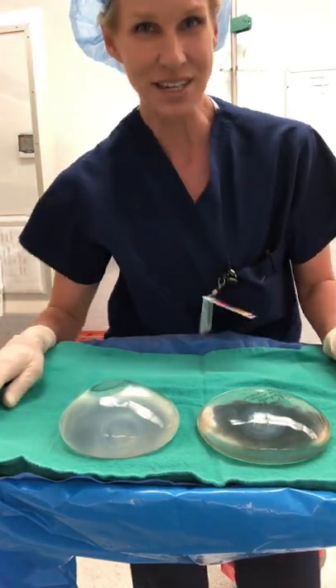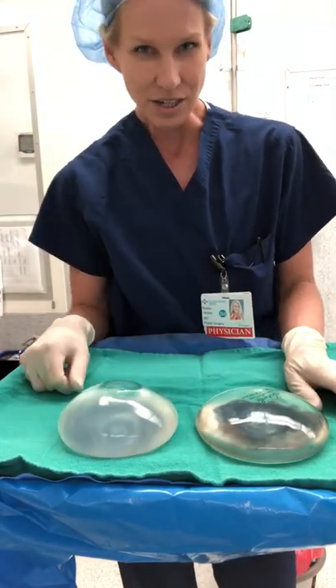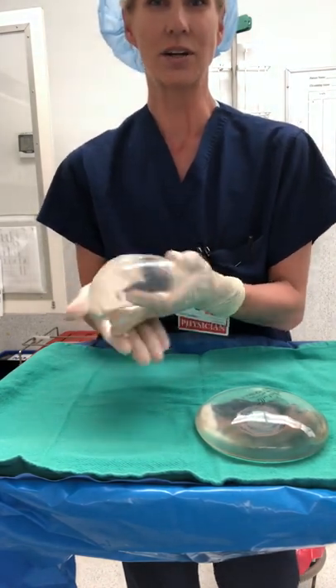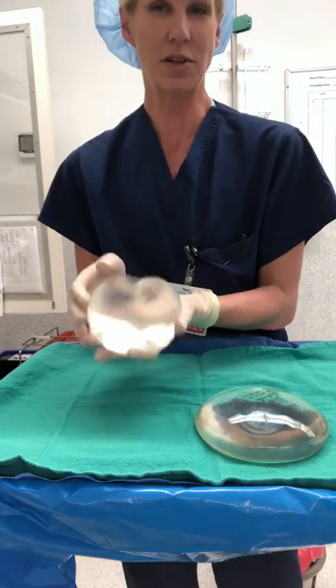I wanted to show you the difference, I just finished surgery, between a saline-filled breast implant and a silicone gel breast implant. A saline-filled breast implant is filled with saline, which is sterile salt water. It can jiggle, it can ripple if you have thin skin, and it flows less naturally.